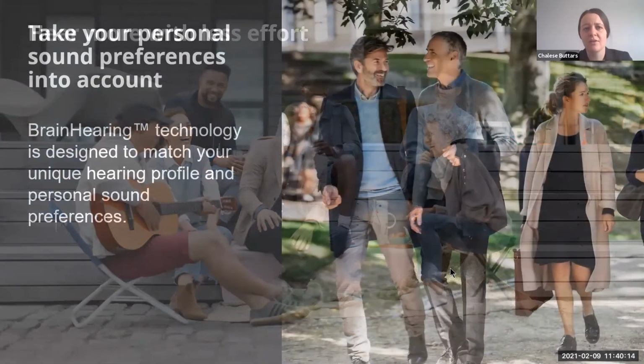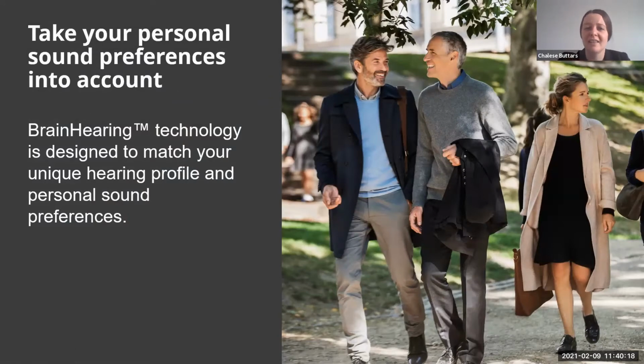Now, one of the nice things about hearing aid technology in general is the fact that the hearing care provider you work with can fine-tune and personalize that hearing aid for you. Now at Oticon, we have another layer of this personalization built into our software, where it programs the hearing aid specifically to your listening preferences. But besides that, even in all of the other hearing aid manufacturers, hearing aids can be specifically tailored to you and to your needs. Like Anne was talking about, if you have difficulties, you can go into your hearing care provider and ask them to create a different type of mask program so you can have increased understanding.